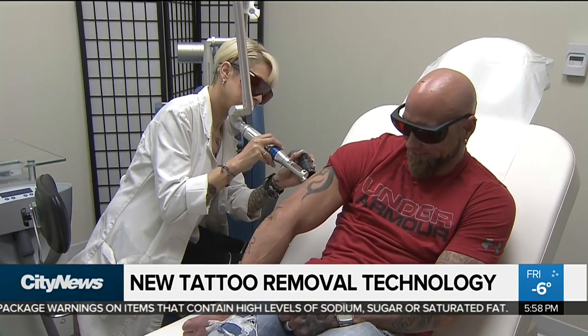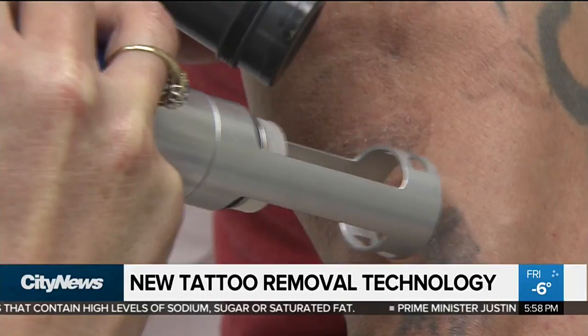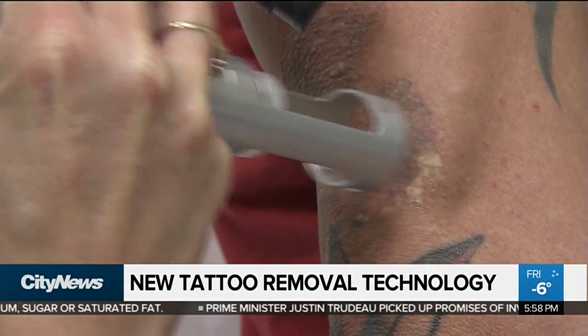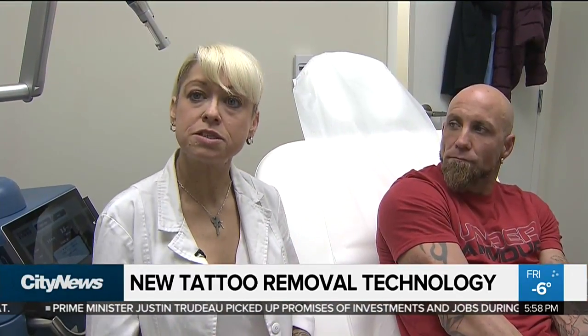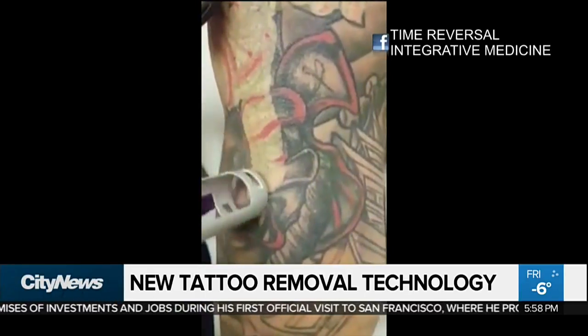While the skin is not burned, it is common to get blistering when the laser blasts away any color of tattoo ink. However, Michelle says with this new machine it's really only the red colors that will blister — less aggressive results, quicker healing time, no blistering, no scarring, and hyperpigmentation is not permanent. Typically we see a patient every six weeks.